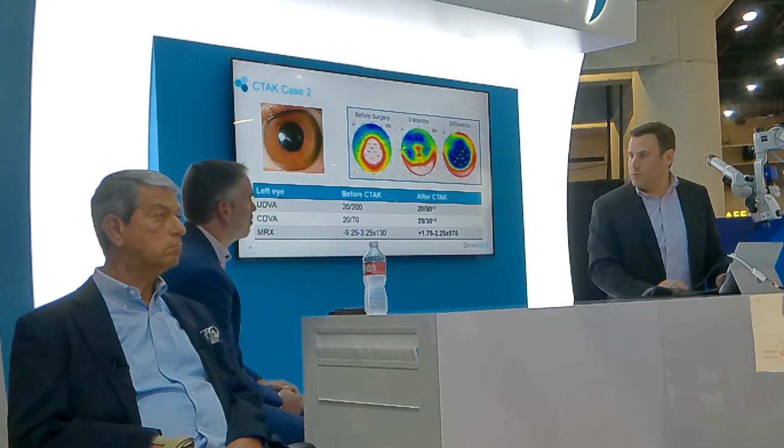So I'm going to turn it over to Dr. Berdahl. He'll also go over his early experience with CTAK as well.